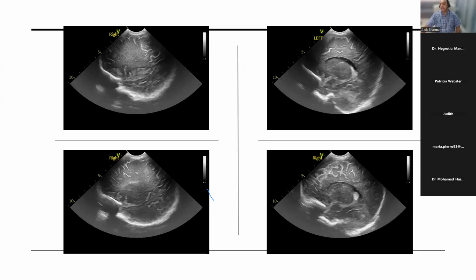And basically, what they say is that cranial ultrasound findings really lack sensitivity and specificity with infection. So you just have to be extremely careful. You need to clinically correlate because in a completely normal baby, the two questions that I would really ask myself are, what is my time gain compensation and am I using it properly? Is that what explains the difference in the sulcal highlighting? But in a baby like this, clinically, I'd be very worried about the possibility of meningitis.